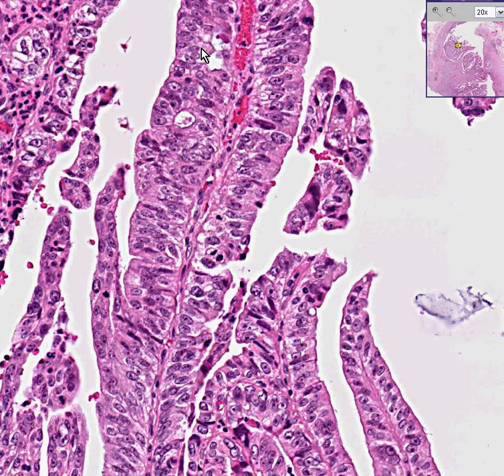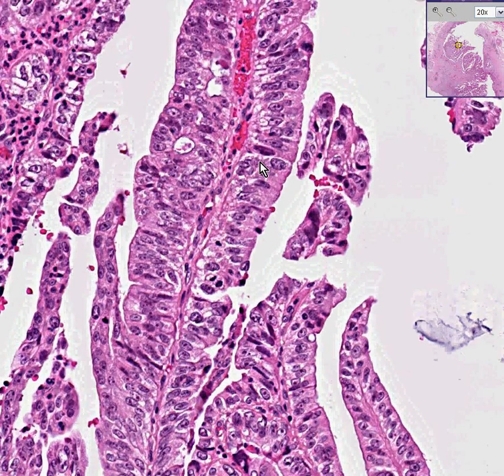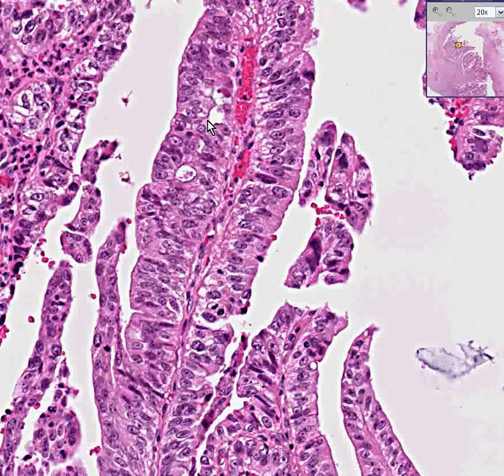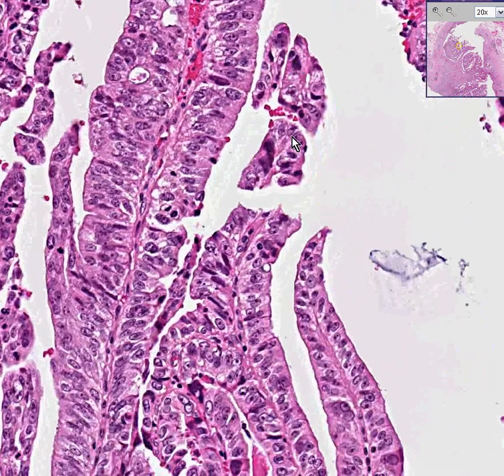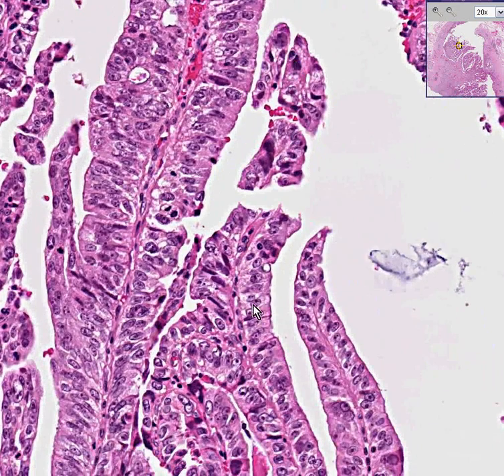There is no doubt that these are malignant cells. There is no doubt that they are glandular cells. Look at the considerable variation in nuclei — size, lumpiness, and staining properties. Look at how some of them are very dark, very hyperchromatic and irregular.